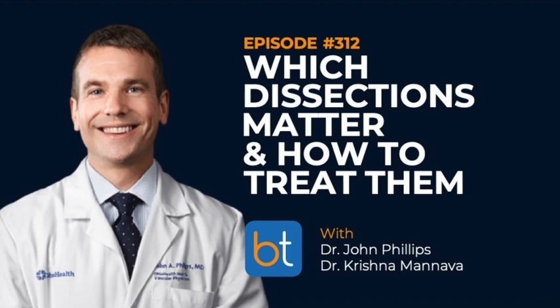Is that different for you than stenting? Meaning like atherectomy? So medical therapy, dual antiplatelet therapy or anticoagulation. Do you handle that differently with tacks? No. For us, it's DAPT for probably 3 months and then reconsidering monotherapy thereafter. So we treat it as an implant and a stent.